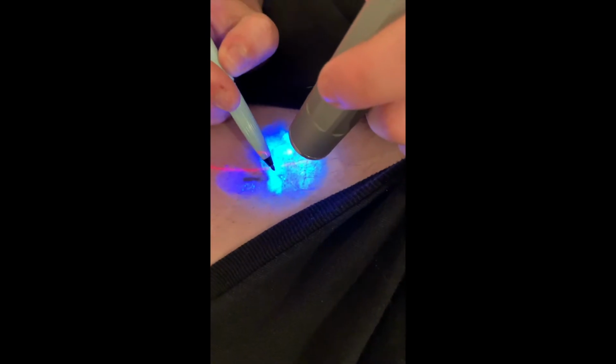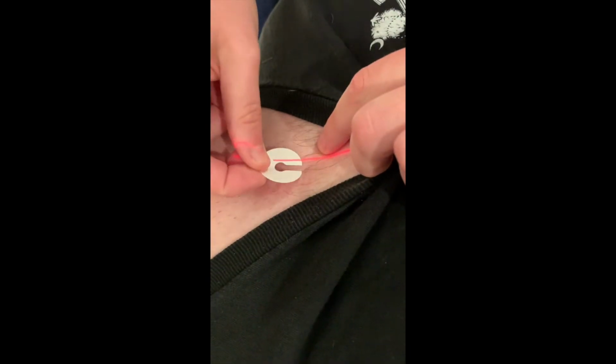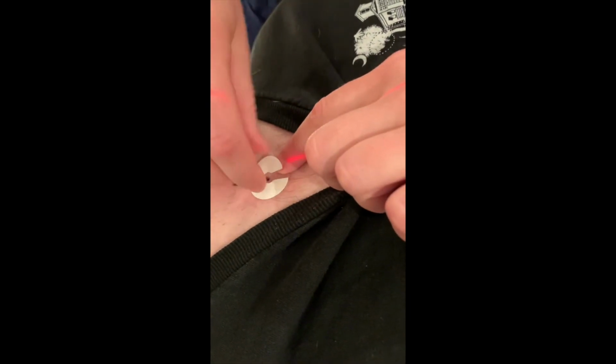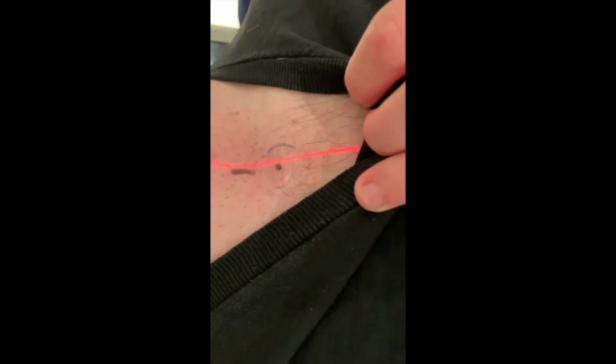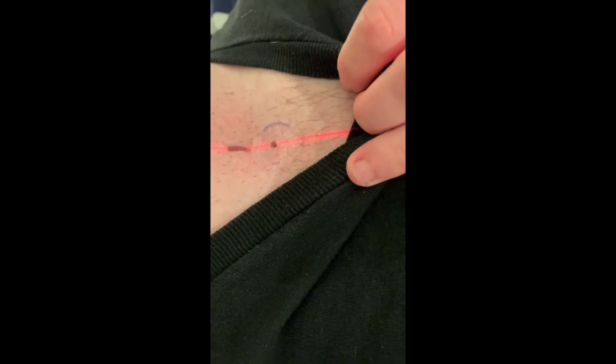To further assist with your daily setup, the therapy team may also place a Tegaderm, which is a breathable sticker, over the mark and tattoo. If this is placed, please check with your therapist before removing it. After receiving the tattoos, your body will begin to heal, and you may notice the area becomes red and itchy. It is important not to scratch these areas, especially while healing. You can bathe normally after receiving these tattoos, as they will not wash off.